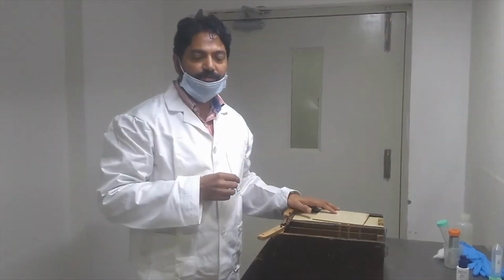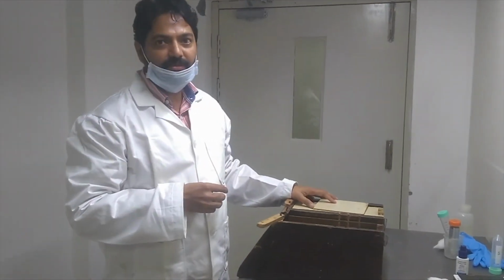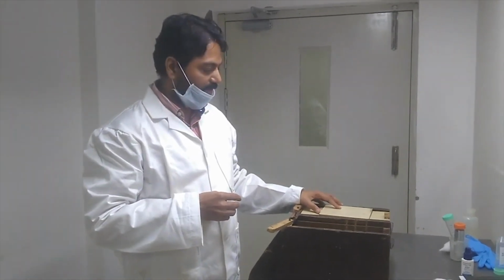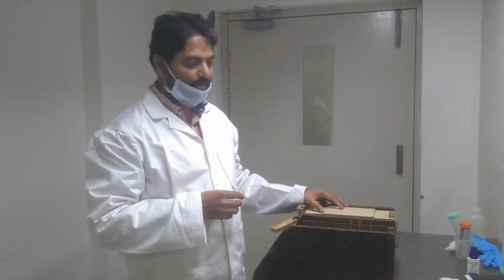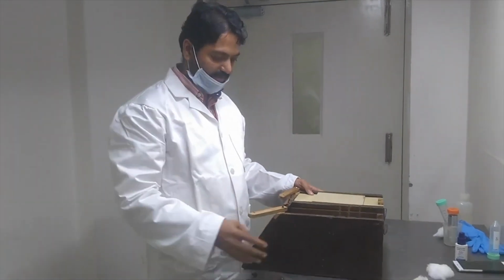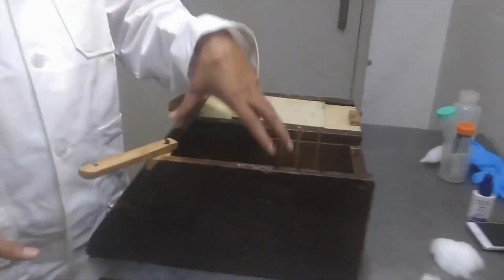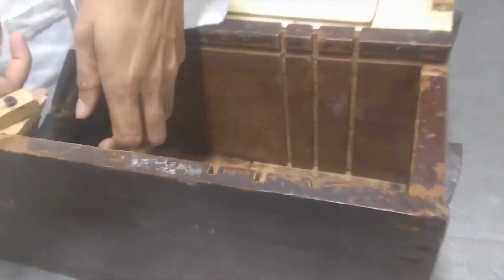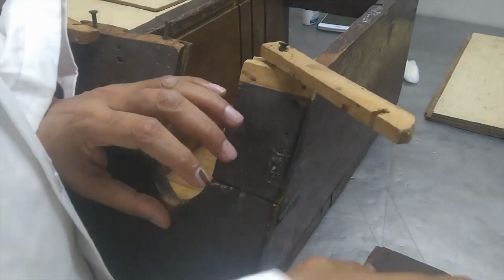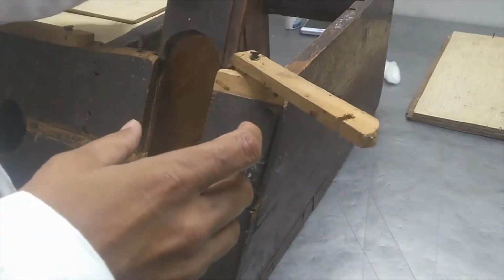When we have to bleed, we have to restrain the animal, because in general it is not advisable to anesthetize the animal. So we use this wooden restrainer, where we keep this rabbit here, keep its neck inside and the head outside. Then we restrain its neck using this.